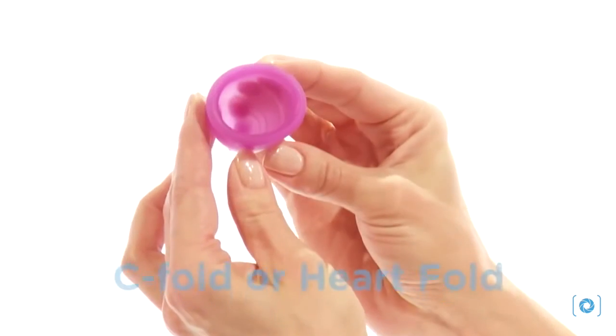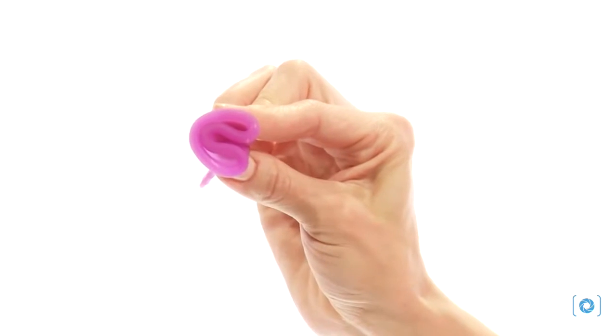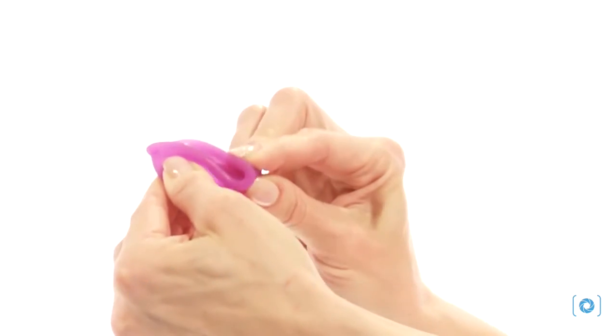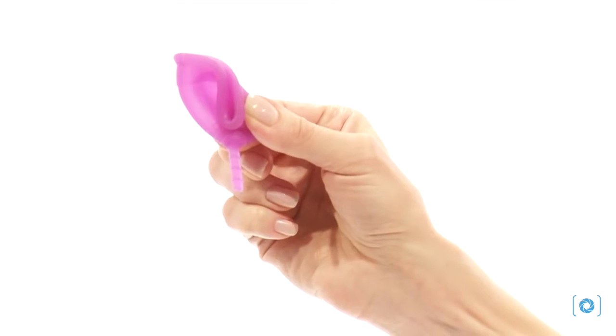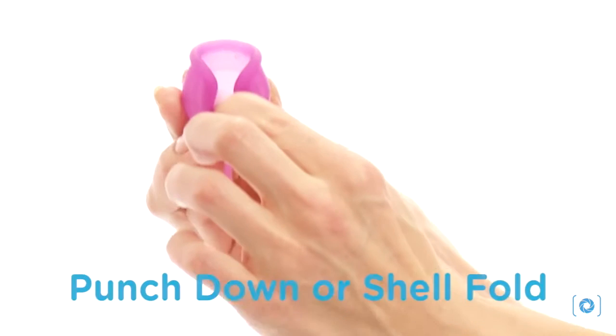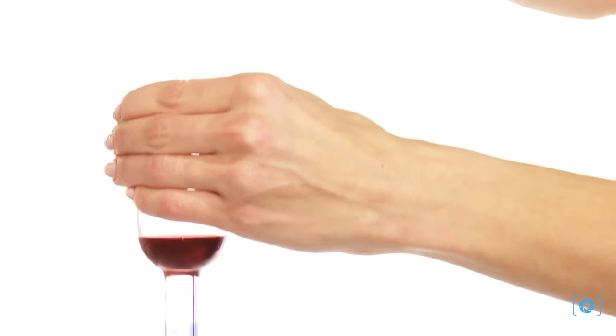We've assembled the most tried-and-true folding strategies to make Lunette work for you, right here. Fold the cup, keep it rolled up, and guide it rim-first into the vagina.